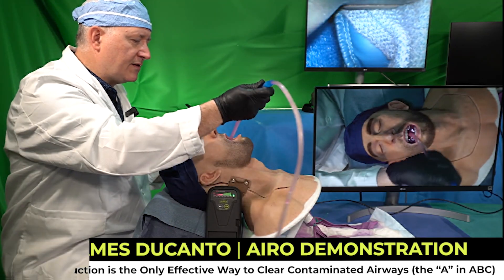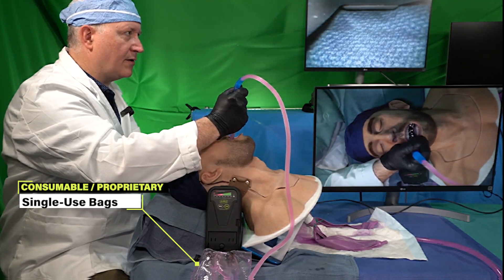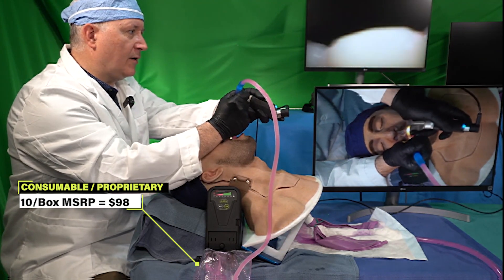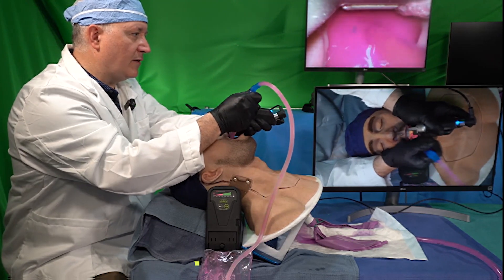I'll begin suctioning the oral pharynx, using the suction catheter to push the tongue into the floor of the mouth. This is going to provide a clear and clean path for the insertion of the video laryngoscope blade.